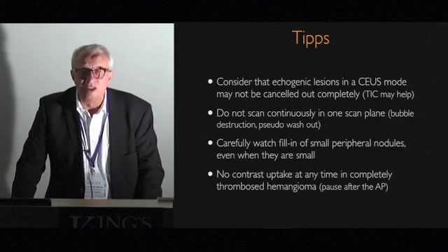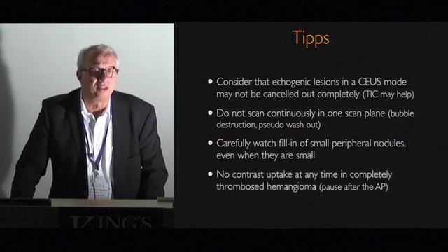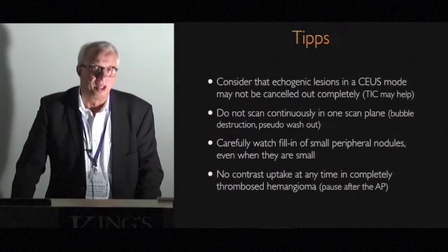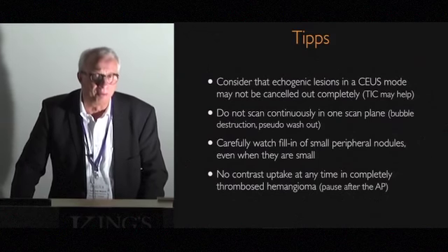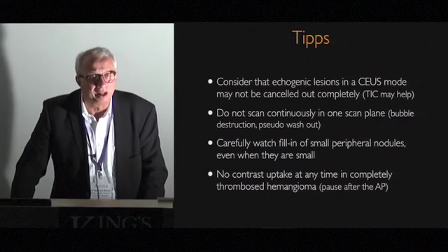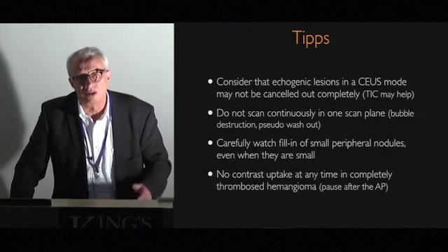Do not scan continuously in one scan plane. I think this is one of the most important points, because then you destroy bubbles. And the longer you scan, the more bubbles you destroy. And then it looks like the lesion has been washed out. But that is artificial, that is due to your scanning technique.